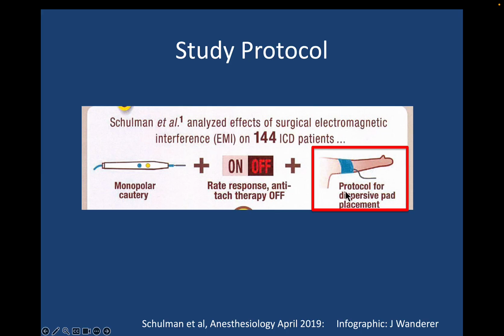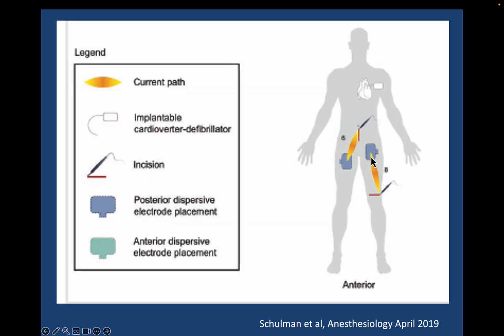They used a very specific protocol for dispersive pad placement, in other words, the bovie return pad. And this is a very good paper, even if you're just reading it for general EP issues, for example, pacemaker management, because this protocol is very useful to keep cautery noise away from the ICD's sensing electrode.